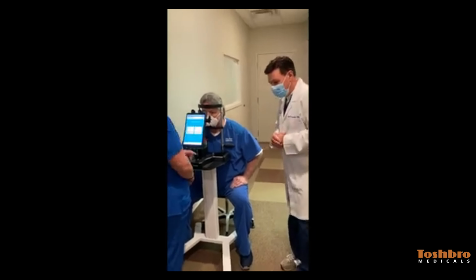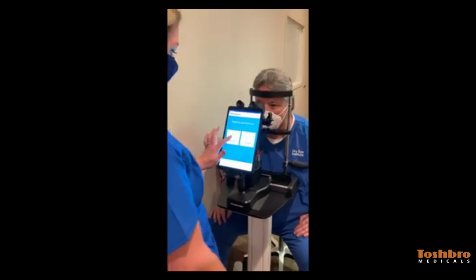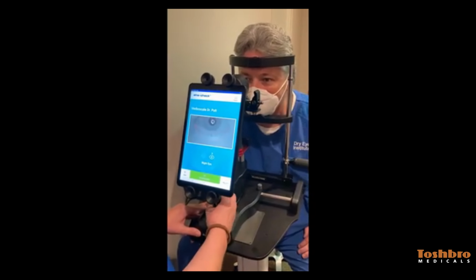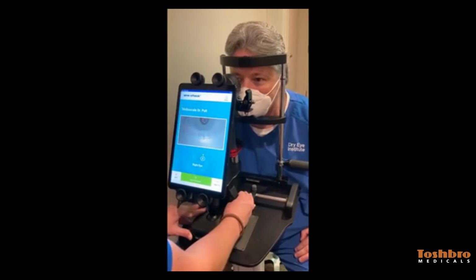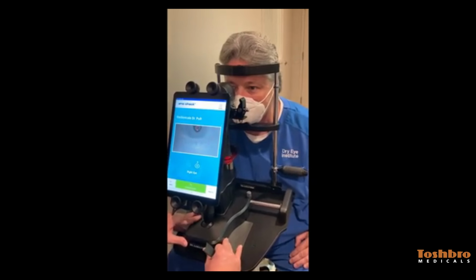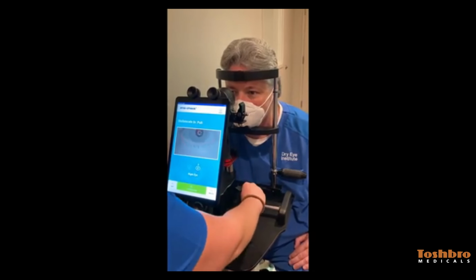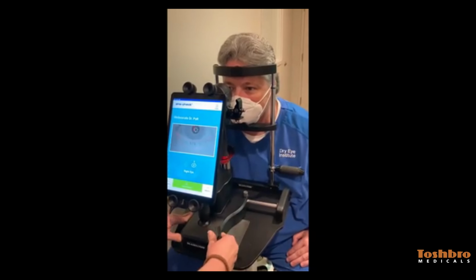All right, I have one of my technician assistants here, Stacy, who's going to take us through the process, and our patient, Michael, here today. So let's select the patient, and we're going to do meibography. This is called the MIBO scale, as we talked about. And you can see the red outline lines up beautifully with the lower eyelid in terms of where your meibomian glands would be. The lights in the pupil are typically what the patient is also seeing. That's a targeting mechanism for them to look at it, to be centered, and to look in that center area. As you look at our alignment, we also have a red light that helps us line up the pupil, or the center of the eye itself. And there's a perfect lineup for the right eye.